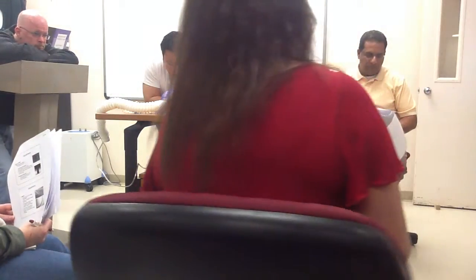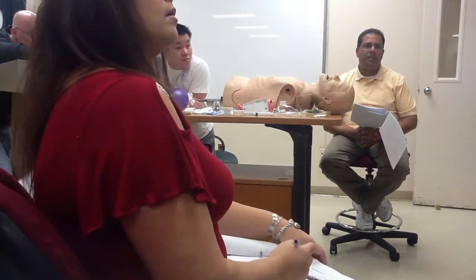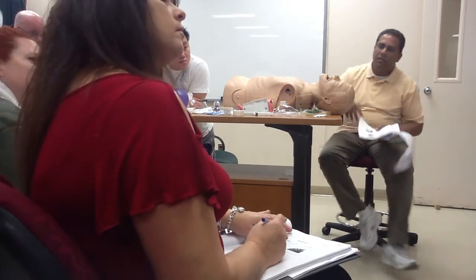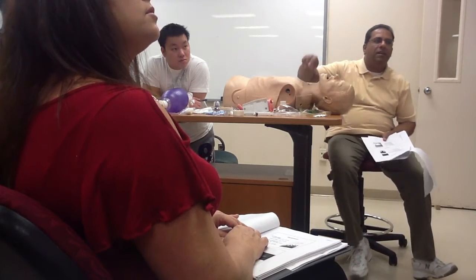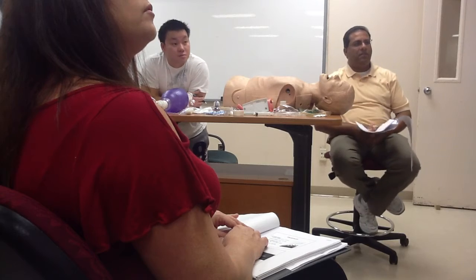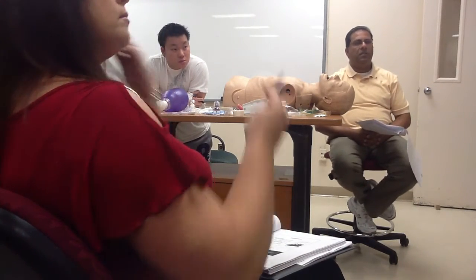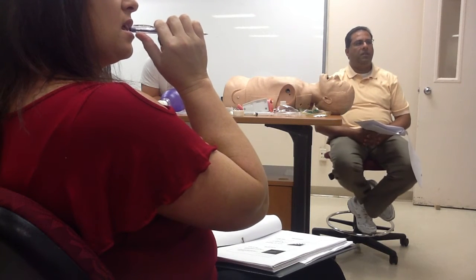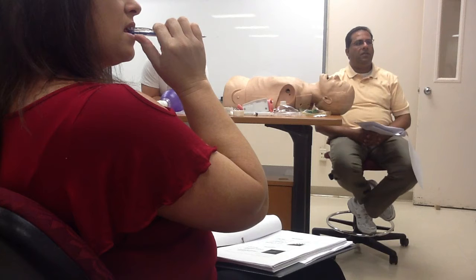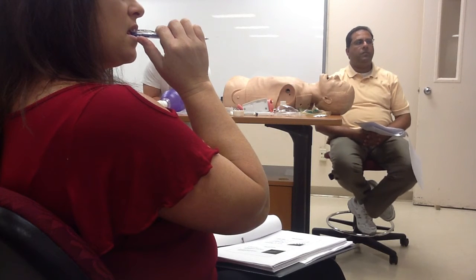And the one ET tube in Helena's hand, look at that, that's a little different than the one that you all have. It has this extra port. It has the hanging suction thing, and then it has the balloon for the cuff. That's for the inflation. This piece inflates the balloon that will block off the trachea. This piece, and I'll pass this around, if you look right up at the bottom, there's a hole here.